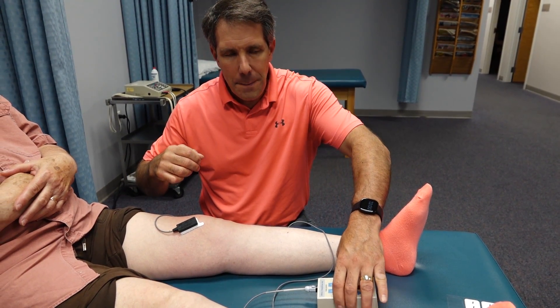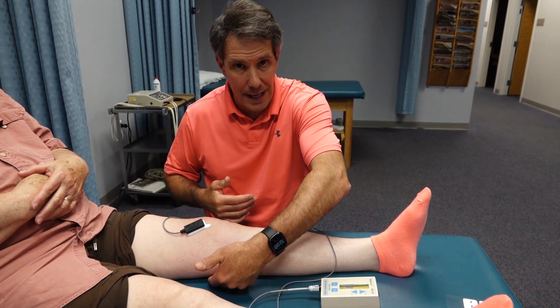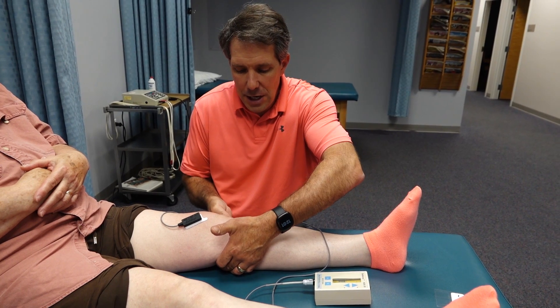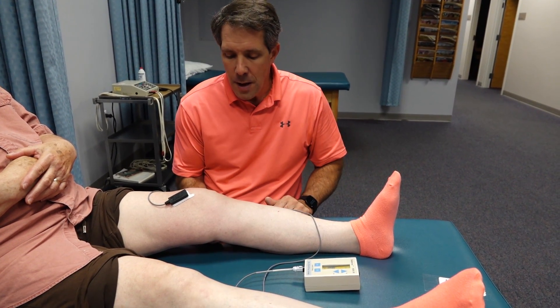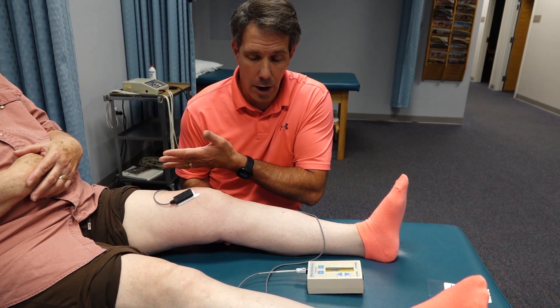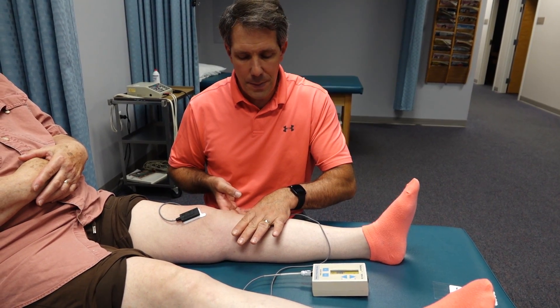Now, sometimes people have difficulty doing a quad set if they don't have something to push up against. So if you're lacking extension, this may beep a little bit because the biofeedback will pick up a little bit of motion. When she first came in, she was like this and she couldn't contract her quad at all. Now that we have her a little bit straighter, she's able to do a little bit better.